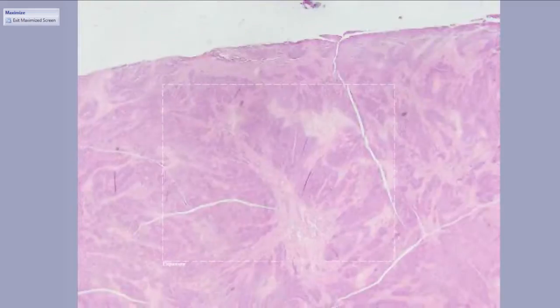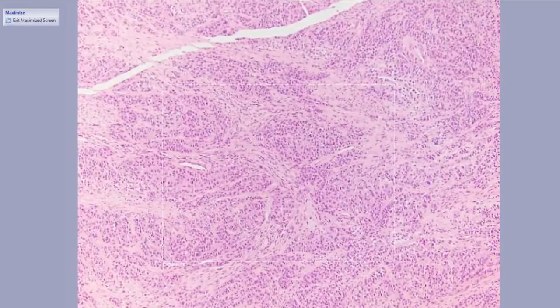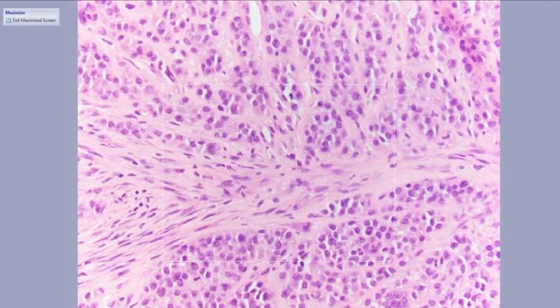We have another stomach mass, and this is also really ugly looking. This is clearly sheeting out, doing whatever it wants. We've got a little bit of normal mucosa here. Let's go in higher power. Not really spindled at all. Epithelioid, mitotic activity, large N/C ratio. Occasionally these giant cell looking things.